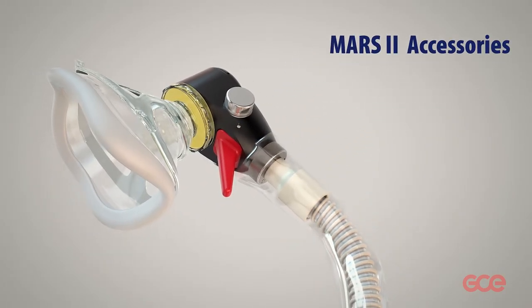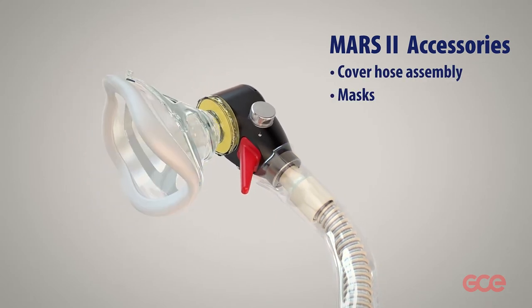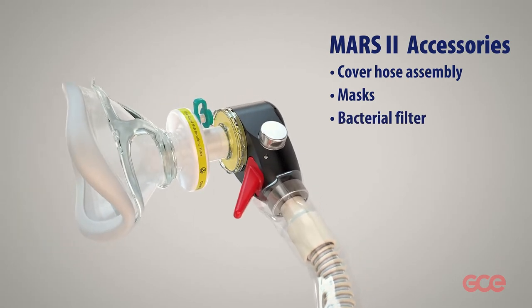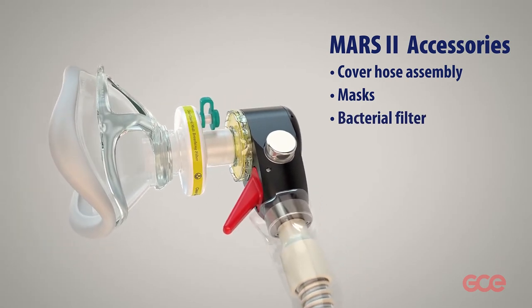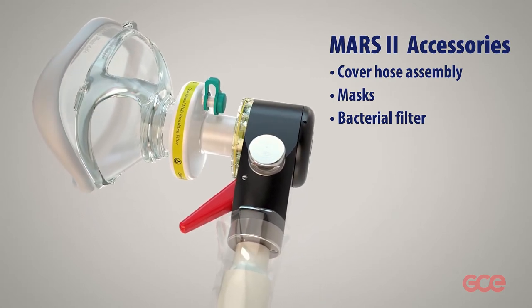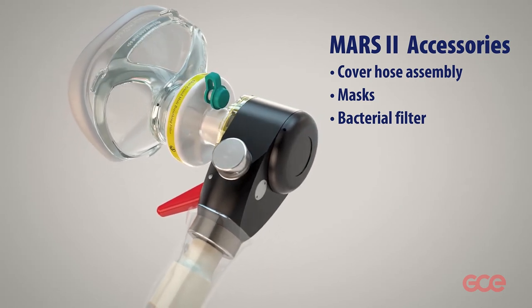Mars 2 is supplied with a cover, hose assembly, masks, and a bacterial filter. When using a bacterial filter, cleaning and disinfection procedures are unnecessary if the filter has not been wetted, moistened, or vomited on during previous use.